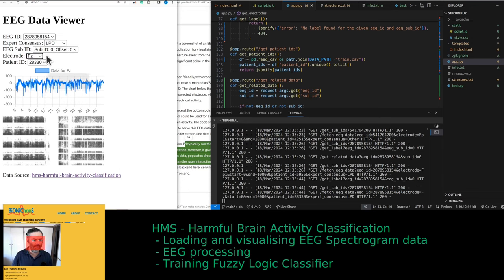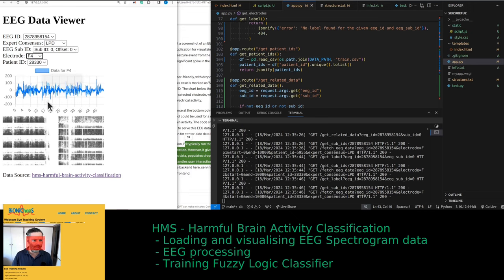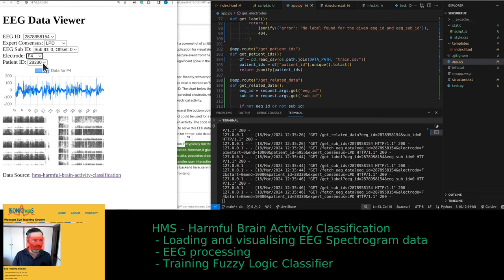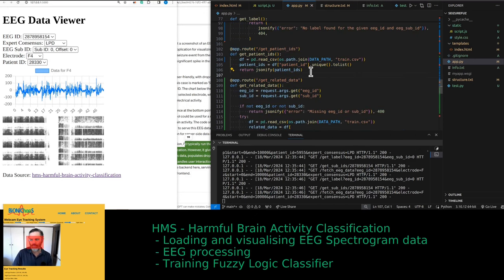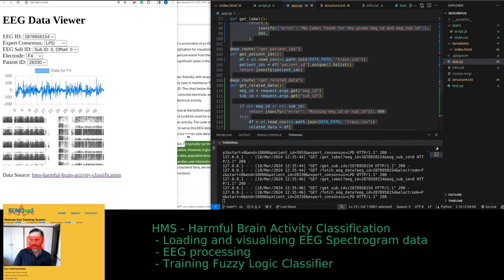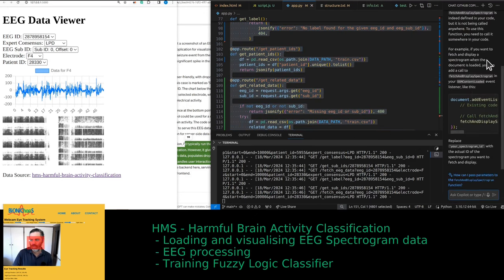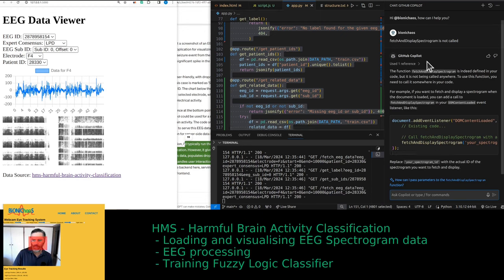You can look at the data on different EEG channels and see the patient ID. This is a back-end thing and this is what we were doing last time. The spectrogram is now displayed.